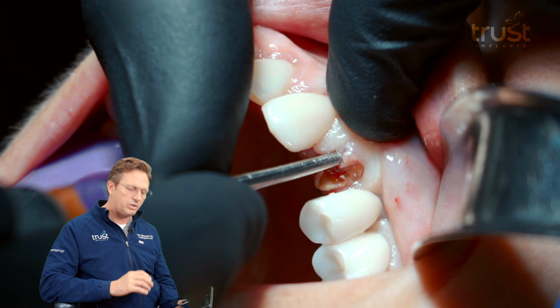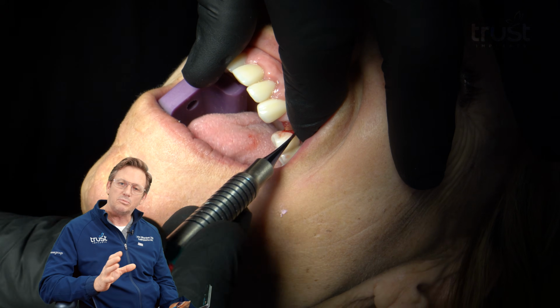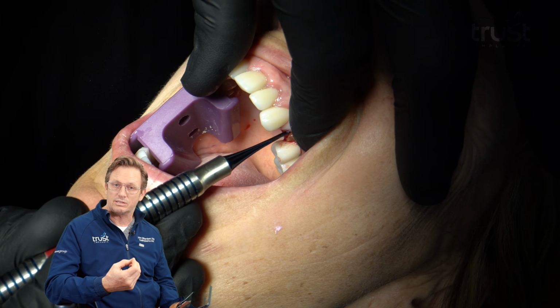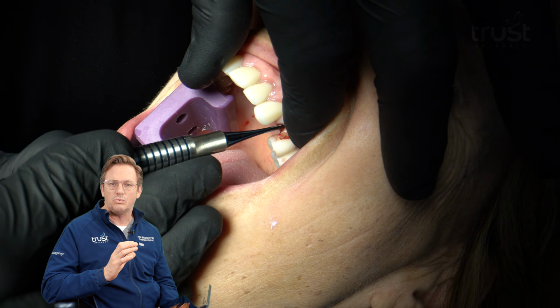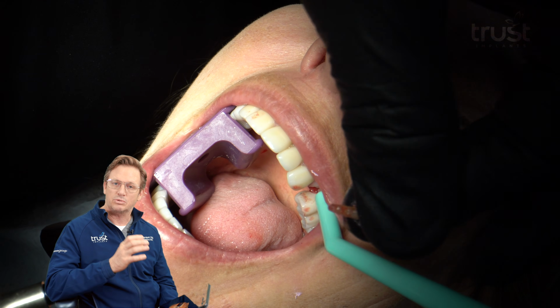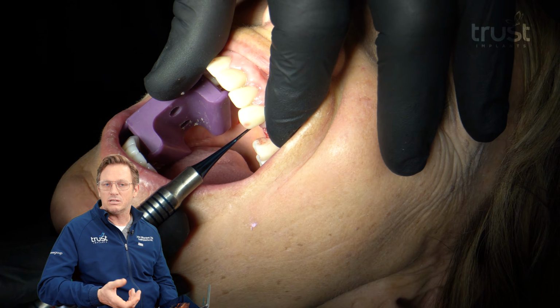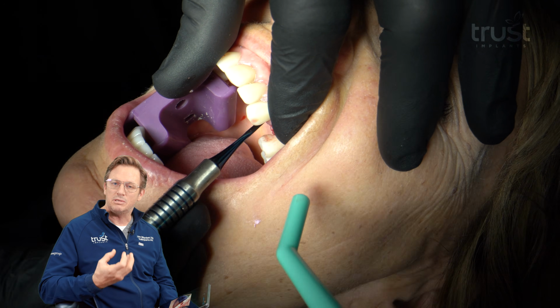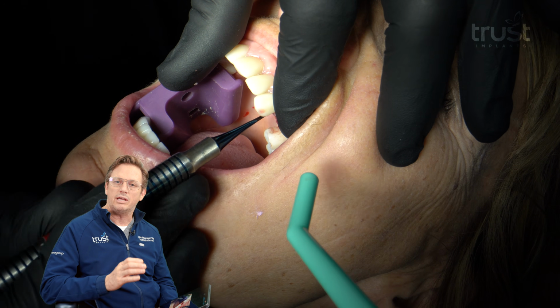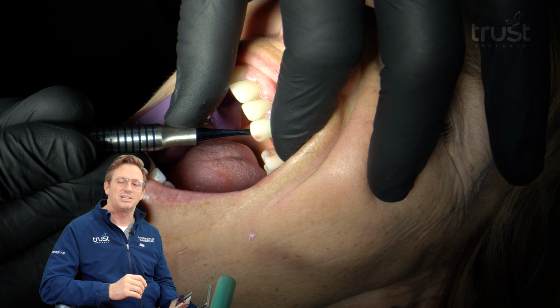Here we're using what we call a periotome, which is a small instrument to help elevate the root and extract the tooth. It's very important when extracting the tooth that we protect, preserve, and maintain the bone. Because sometimes if teeth have had endo or a root canal, they can become ankylosed to the bone. It can be difficult to remove. So we want to preserve as much bone as we possibly can if we are considering doing an immediate placement.